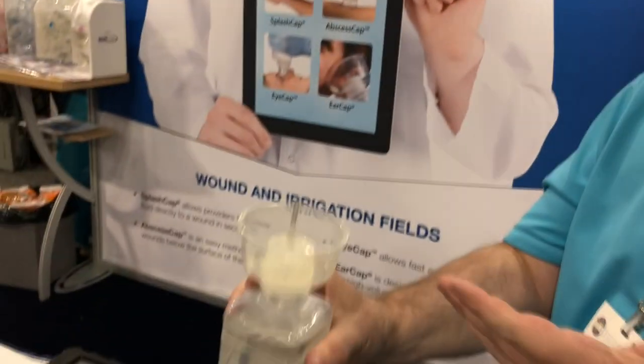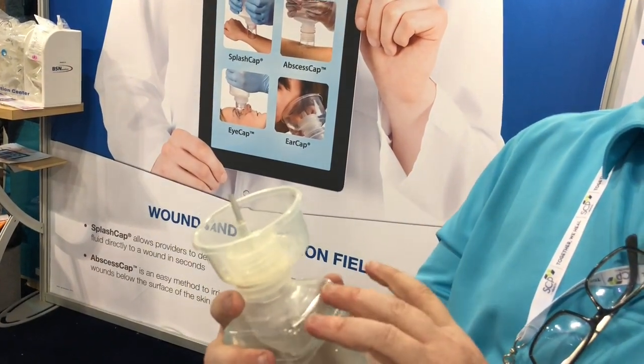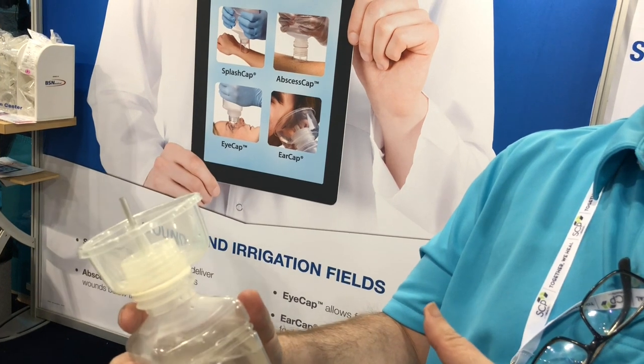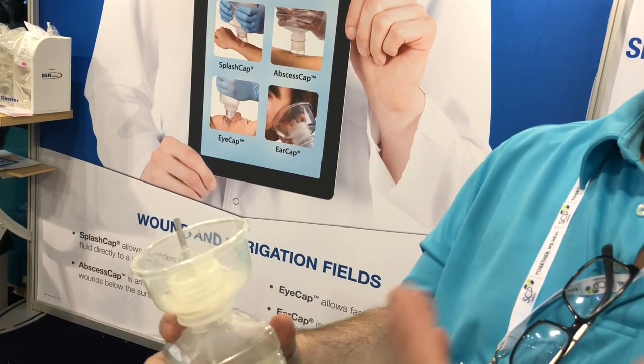This mimics that, except you're using the bottle as your reservoir. So instead of a 60 ml syringe, you've got 500 ml of fluid, making it easier to deliver the volume — just as when you're doing standard wound irrigation with a splash cap, you're able to get continuous volume coming out of the bottle.